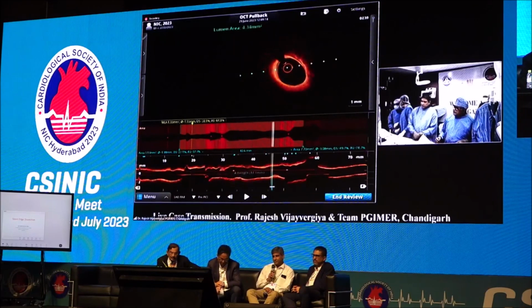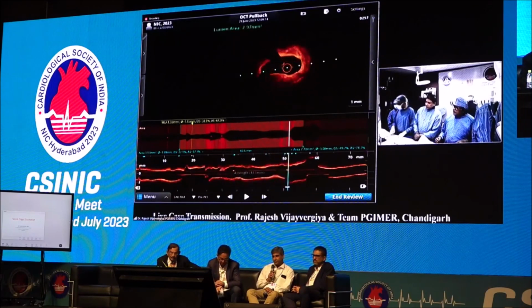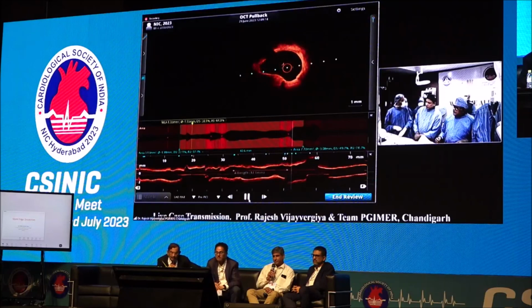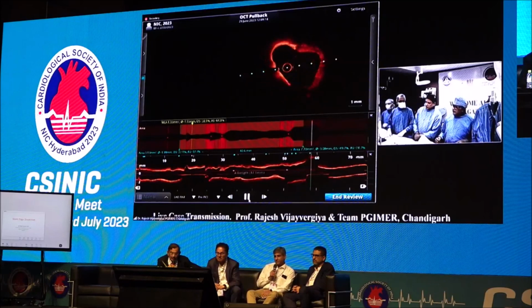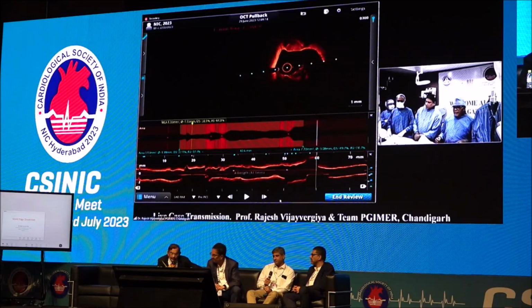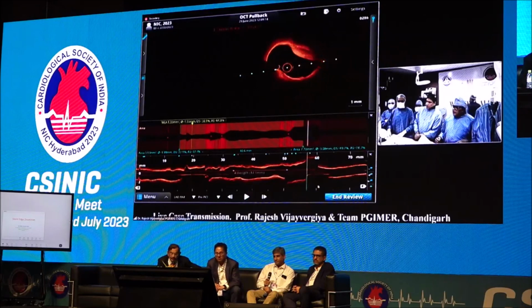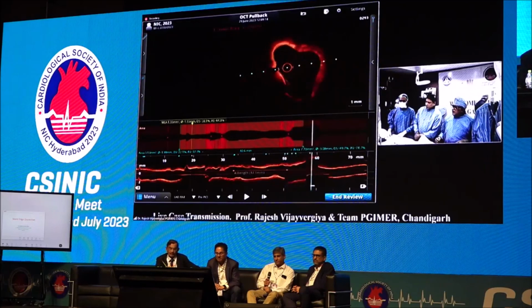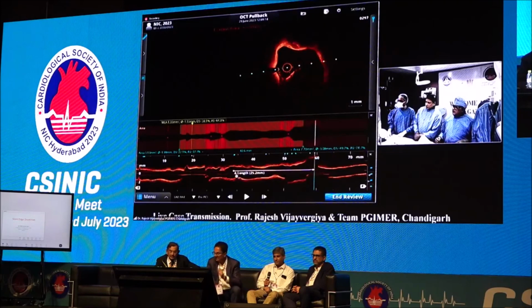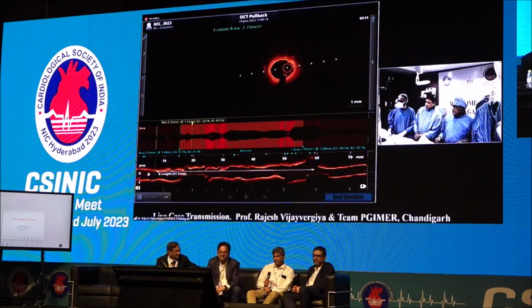So my plan is to go ahead with left main to LAD crossover stenting, and see how to proceed further for a focal lesion across the ostial left circumflex. What is the expected length of the LAD lesion from the ostium? Nikhil, how much is the length? Can you demonstrate ostial left main to mid LAD? This is going to be around 60 millimeter.